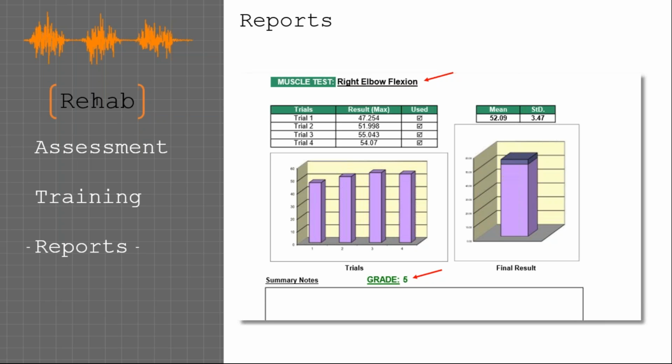Mostly we start talking about our different units. We have pelvic floor protocols, we have general EMG protocols, and then we have things that are more specific, like this manual muscle testing, like our range of motion assessment, that type of thing.